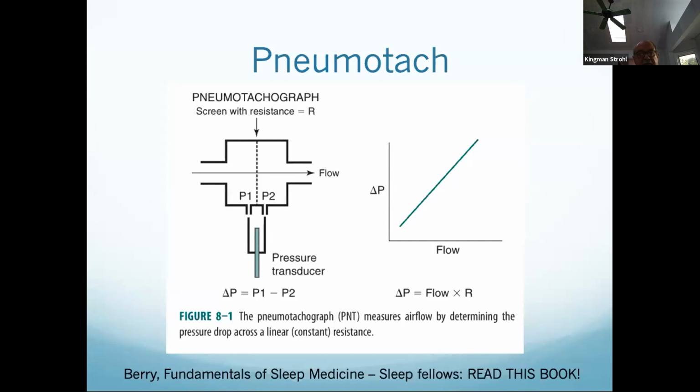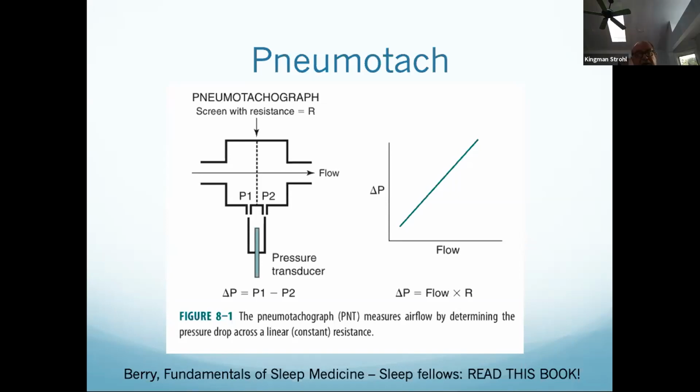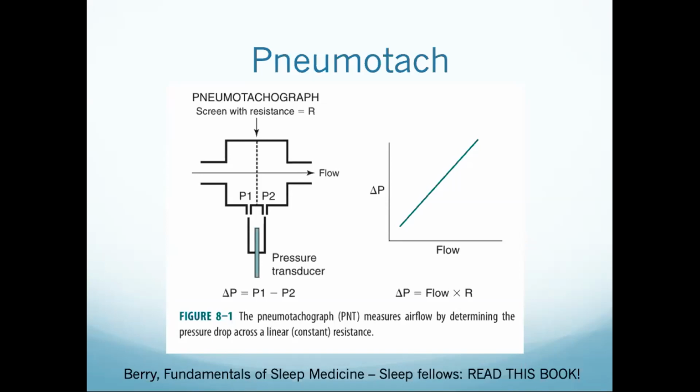It doesn't have to be linear. It can be all sorts of crazy things. But it's this pressure difference, and then it says, okay, this is what changed going through this tube. And this tube could be anything. It could be a nose on one side and lungs on the other, that's the upper airway. But this is called a pneumotach, and you generally put it onto a mask that is put onto the patient's face, and then they breathe in and out of this pneumotach and it gives you a flow signal. And the surrogate for that is pressure. Makes sense. Okay.